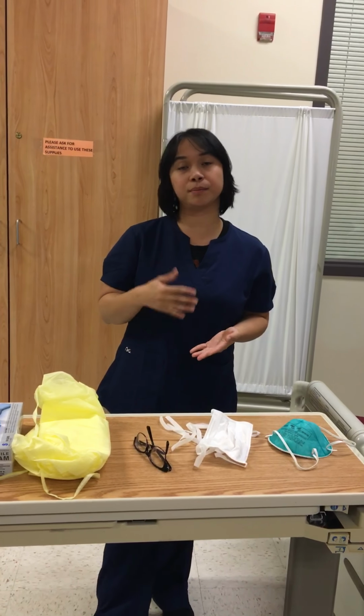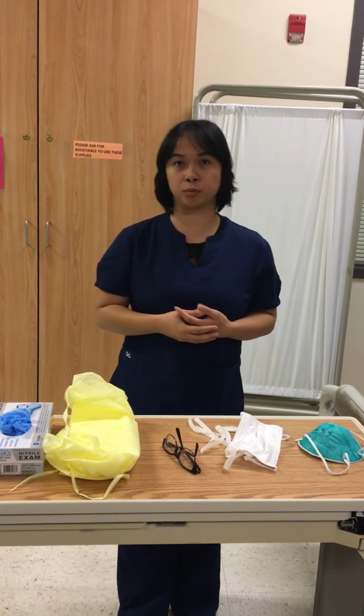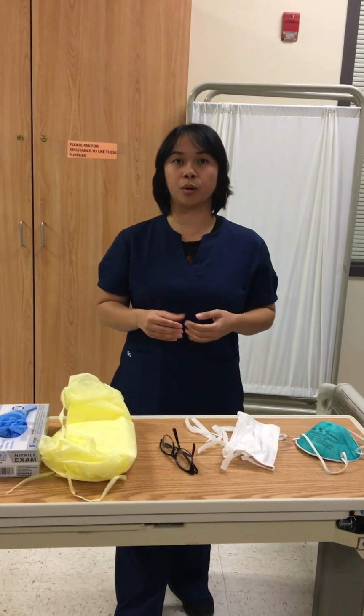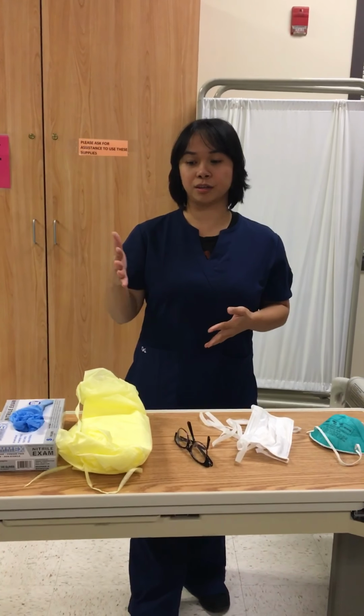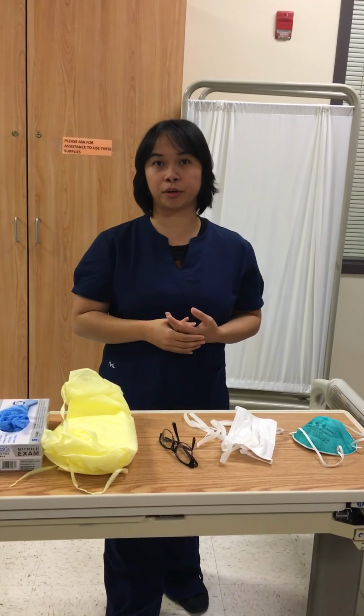So before PPEs are worn, before you enter a patient's room, first you would need to review the patient's chart to see what kind of precaution they're in. It will also say on the patient's door what kind of precaution they're in. So for today's demo, the patient will be in an airborne precaution.